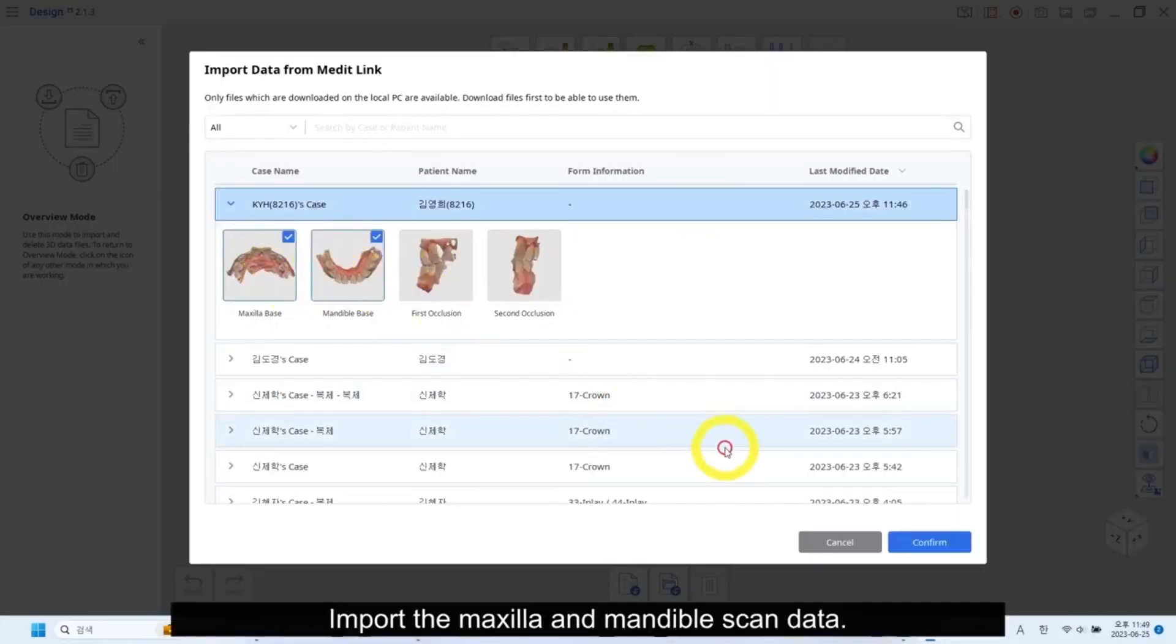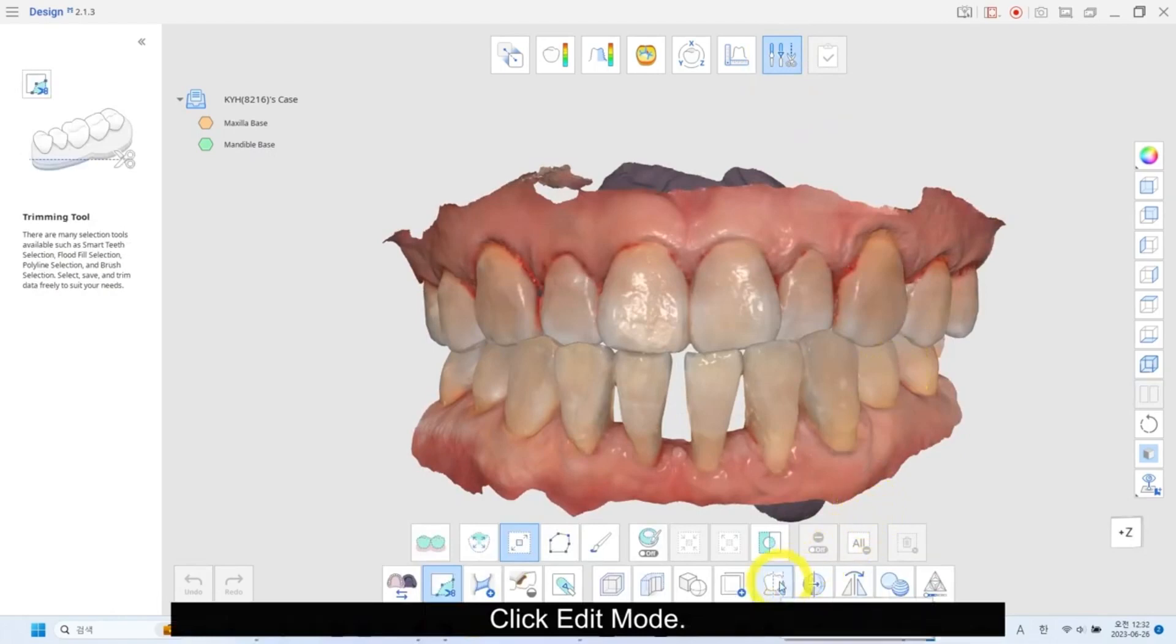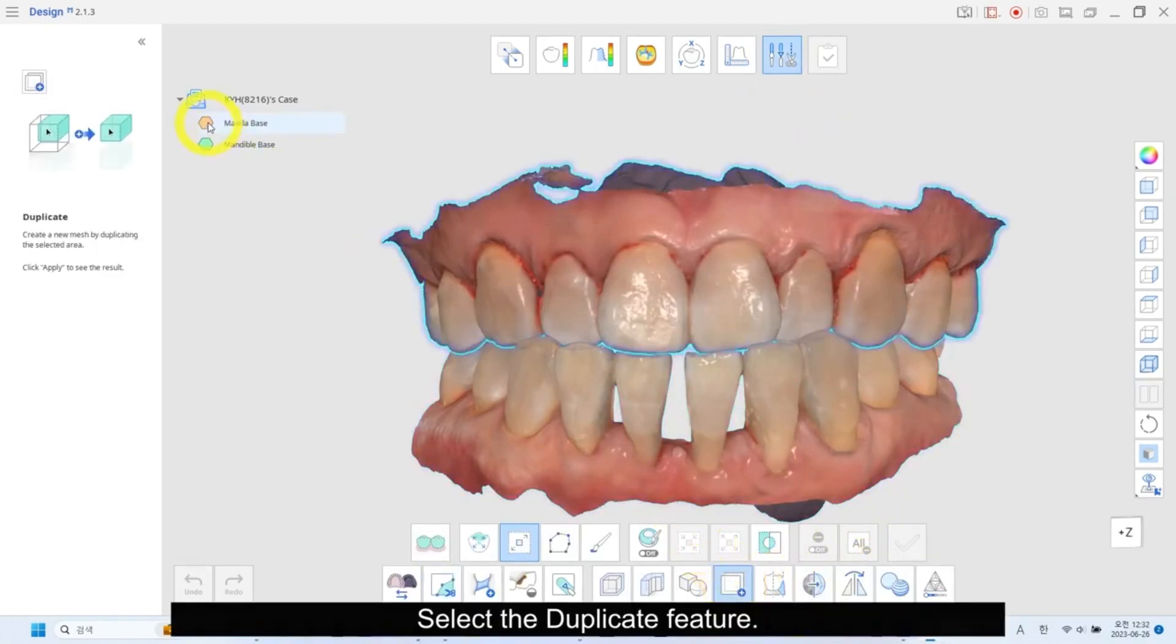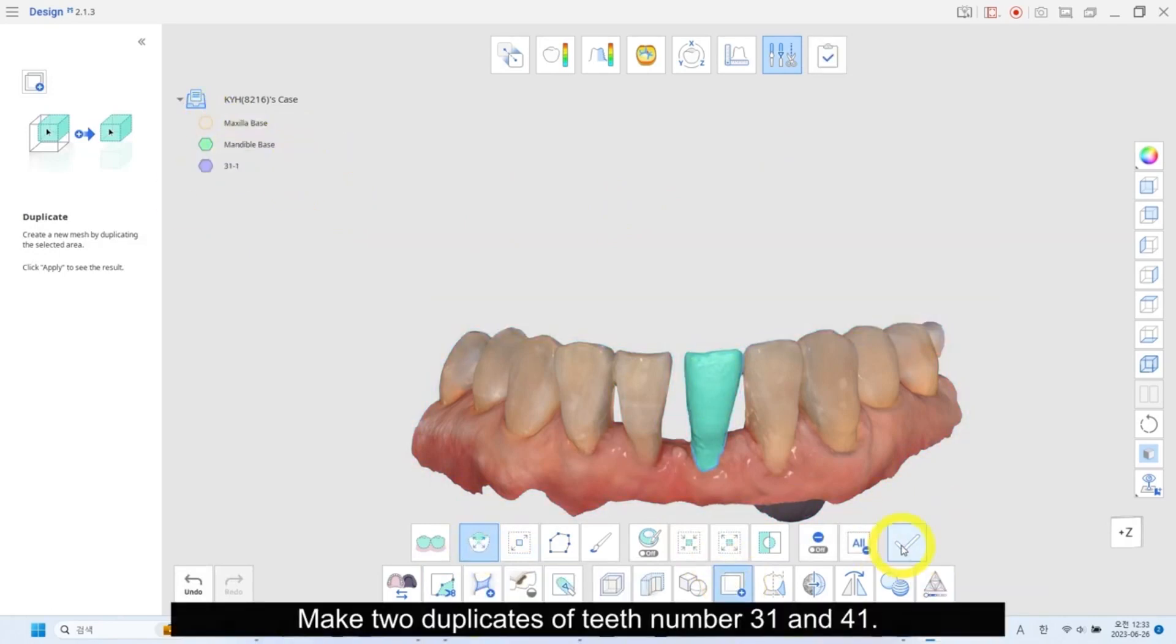Import the maxilla and mandible scan data. Click edit mode. Select the duplicate feature. Make two duplicates of tooth number 31 and 41.